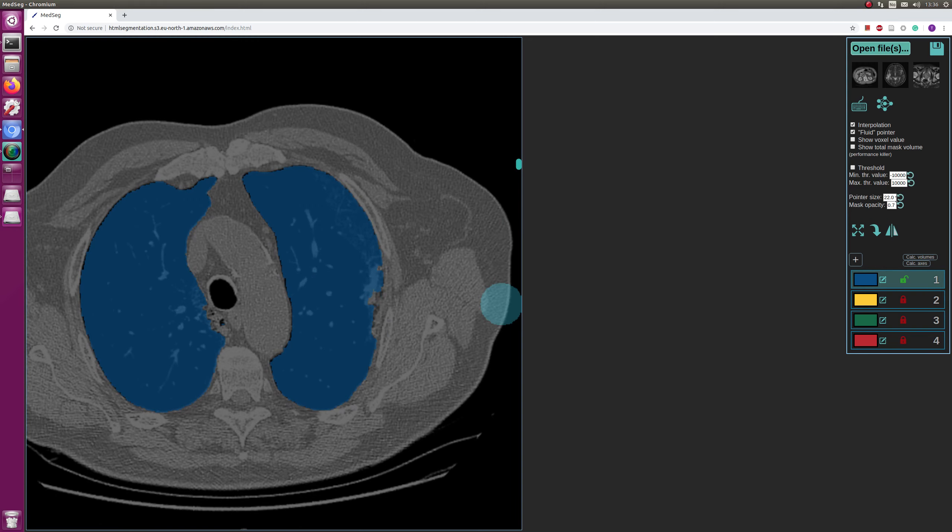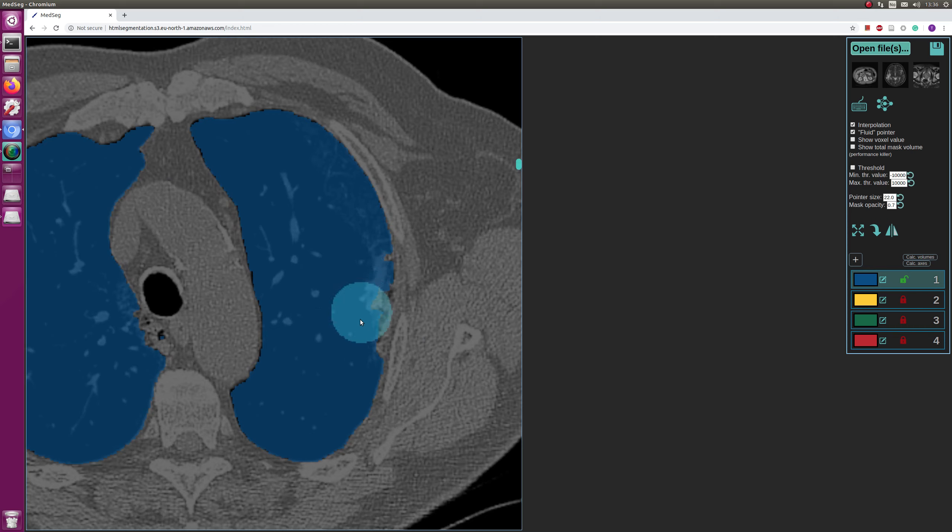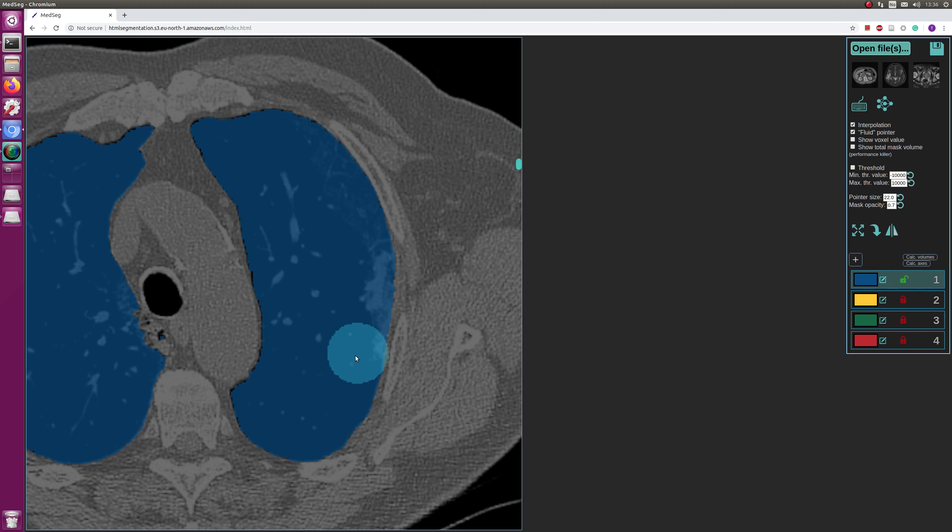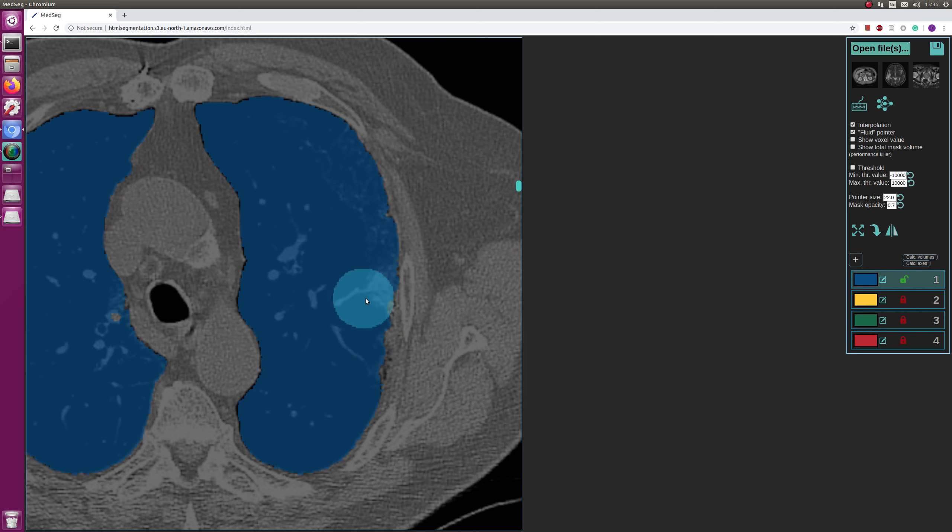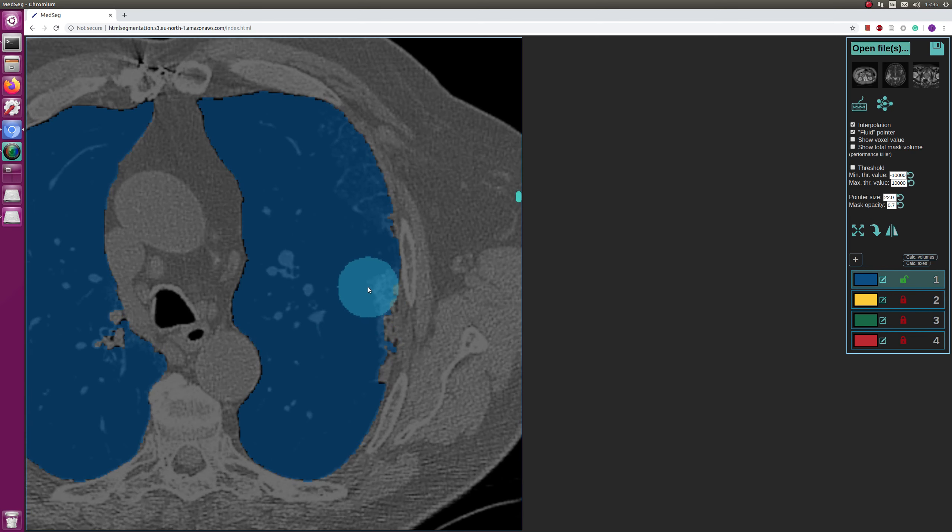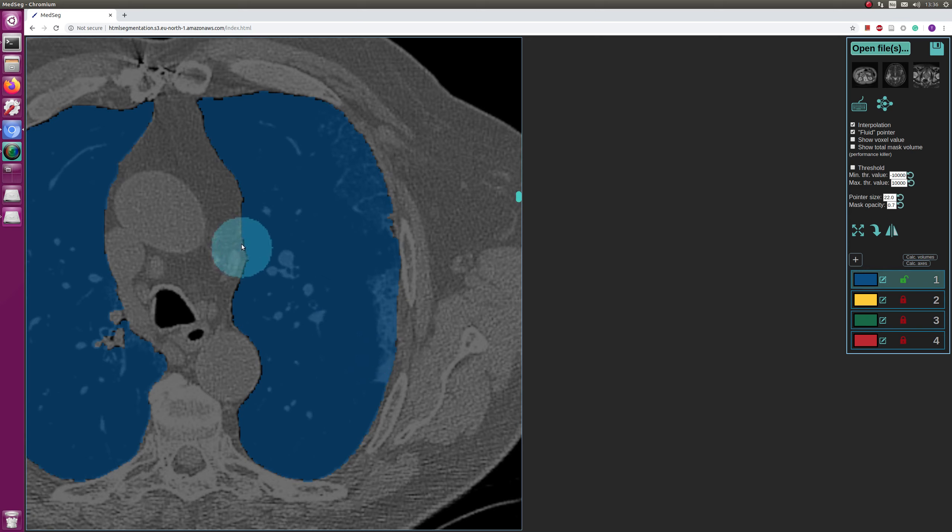So now I don't have threshold activated and that's okay. You can see these are actual opacifications inside the lung, so that is actually lung tissue, so I will correct that.